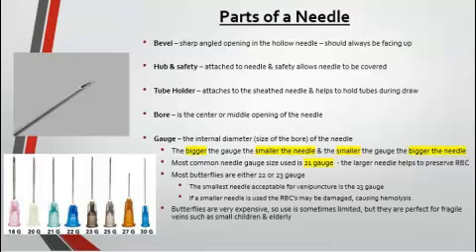Sometimes healthcare facilities want to limit the number of butterflies they use because butterflies are expensive. But sometimes butterflies are necessary when you're collecting samples from fragile veins, like veins of children and elderly patients.